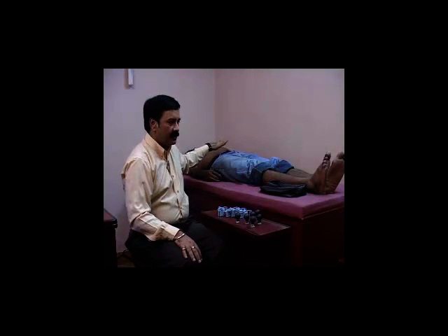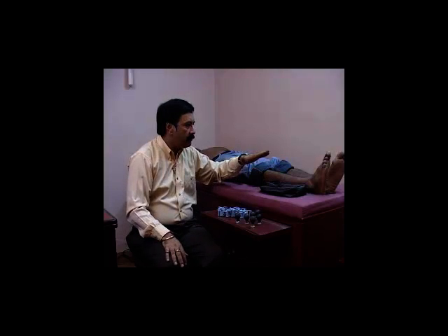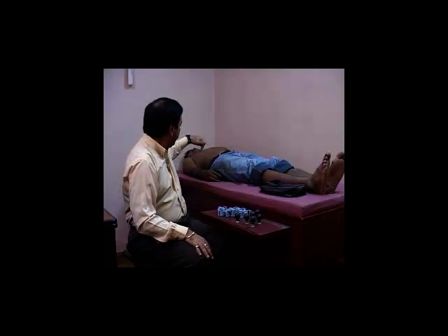To obtain the ECG graph, electrodes have to be placed on standard positions over the limbs and the chest. 4 electrodes are placed on the limbs, 1 each on both ankles and 1 each on both wrists. 6 chest electrodes are placed over the precordium on standard positions.